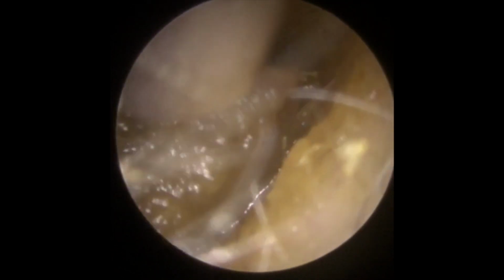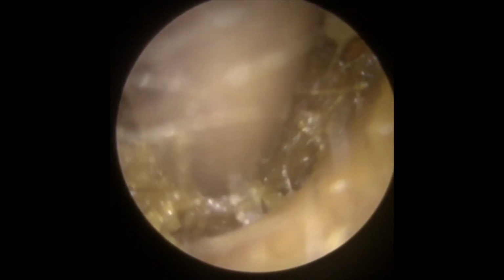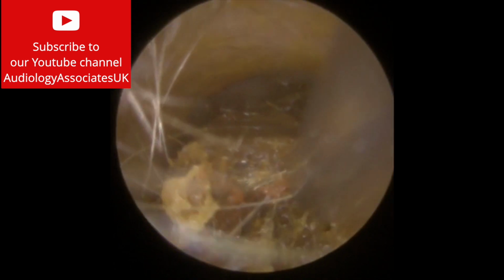The first patient here has come through with reduced hearing on one side, but a sensation of feeling quite blocked up on the other. As we saw from the first shot, there's a tiny gap above this block of wax here. So what we're doing with this one is just lifting this drier wax up from the base of the canal to try and move it out in one piece if we possibly can. Because there's a little gap here, it hasn't really been reducing the hearing by too much, but the patient has been feeling there's something blocking that ear.